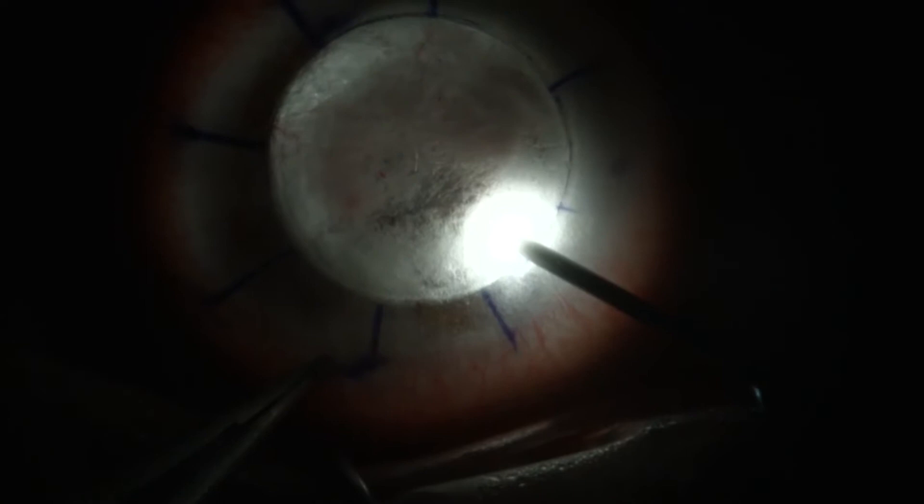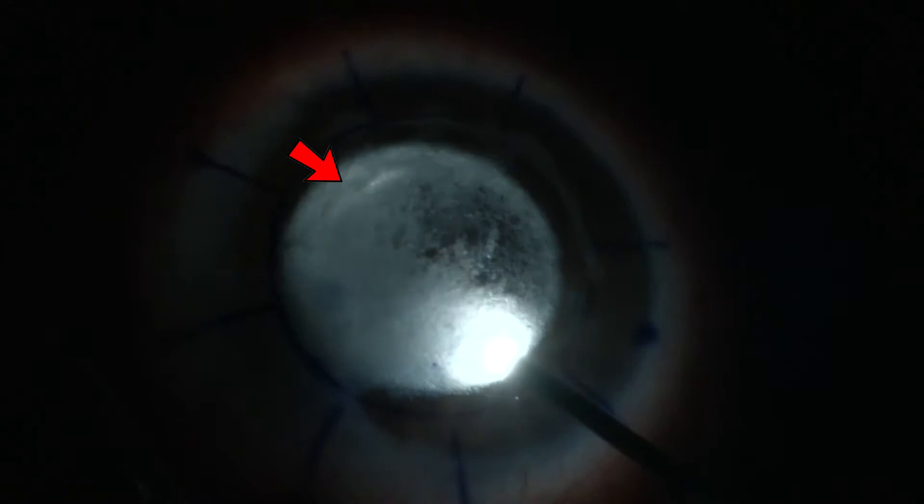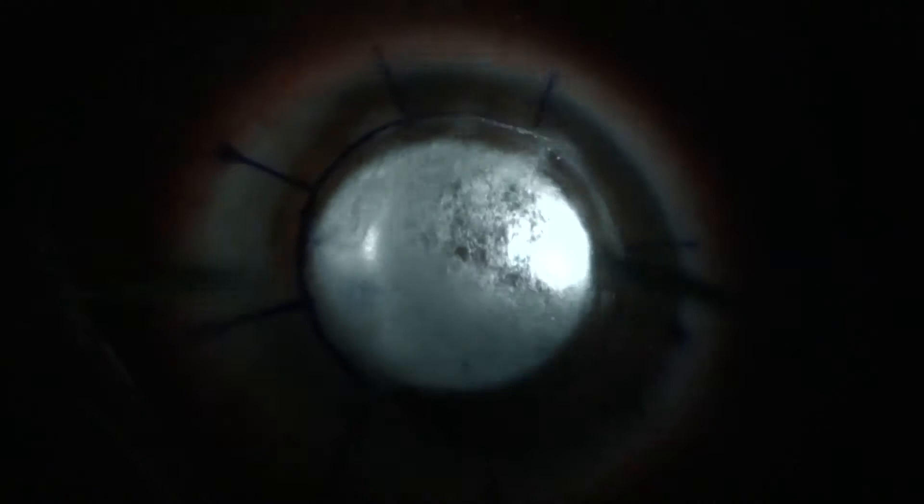It also helps to move the light probe around to check the integrity of the bubble. As we can see, it looks like the light bounces around, again because of the total reflection of the light. The red arrow shows the reflection over the interior wall of the bubble as described by Francis Price as a reverse movement of the inner reflection. Dr. Price's description was made using a handheld slit lamp at the OR. Here the forceps show the same effect.